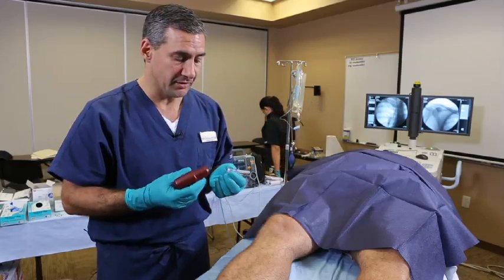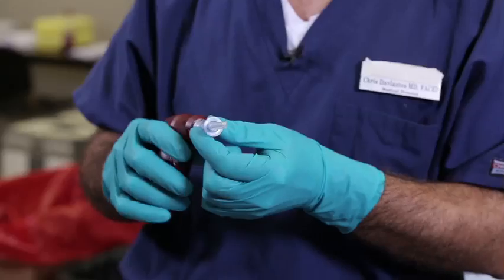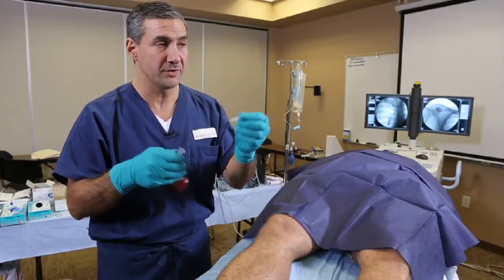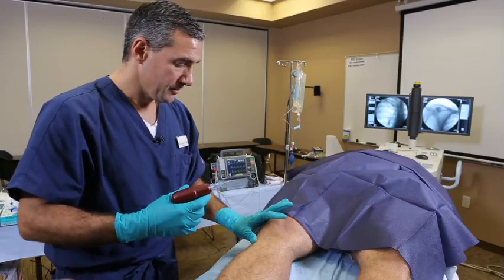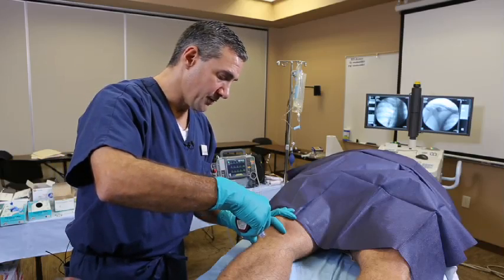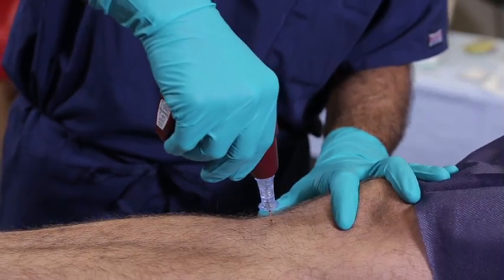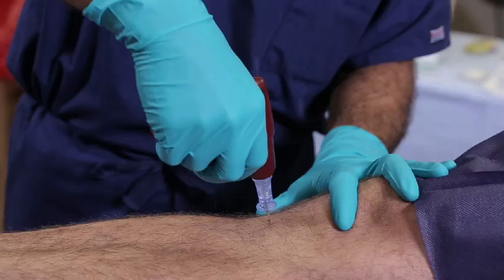After prepping the skin, which I've already done in this case, you want to apply the needle to the driver. It's a magnet that holds the needle in place. You want to stabilize the hub while you remove the cap. You want to insert the needle through the skin until you hit bone, and you want to make sure you see the five millimeter black mark to ensure that you have enough needle to get through the cortex.